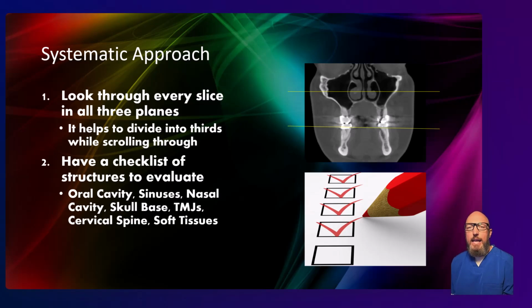Now, we've all taken the dentist pledge to benefit our patients according to our greatest ability and judgment and to do them no harm or injustice. You probably said that pledge twice during dental school. So ensuring nothing important on the volume gets missed is part of that pledge. Interpreting a volume you're not equipped to read is not confidence. It's the opposite of the judgment that we promised.